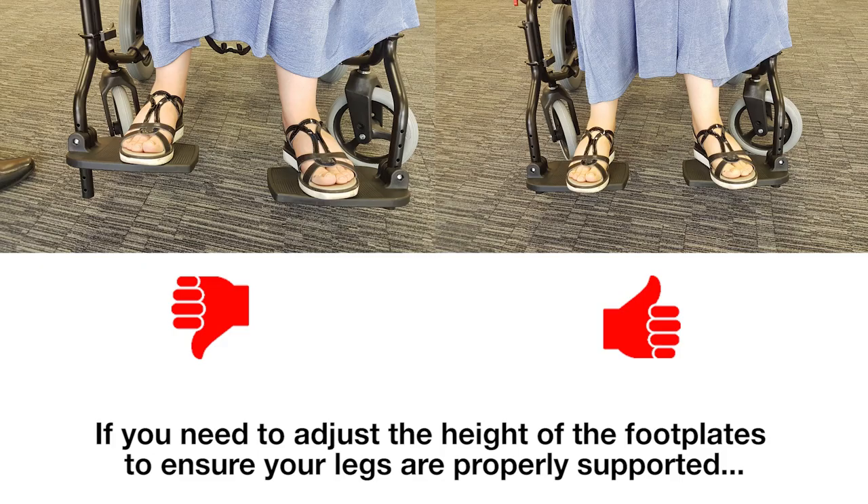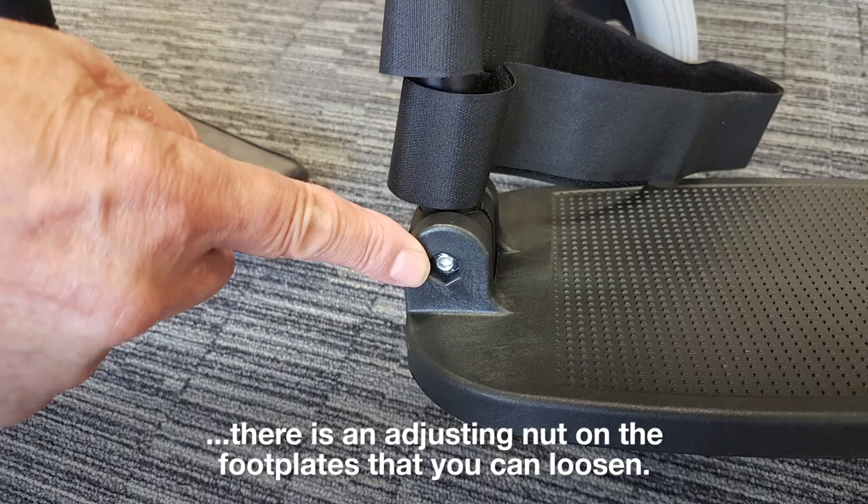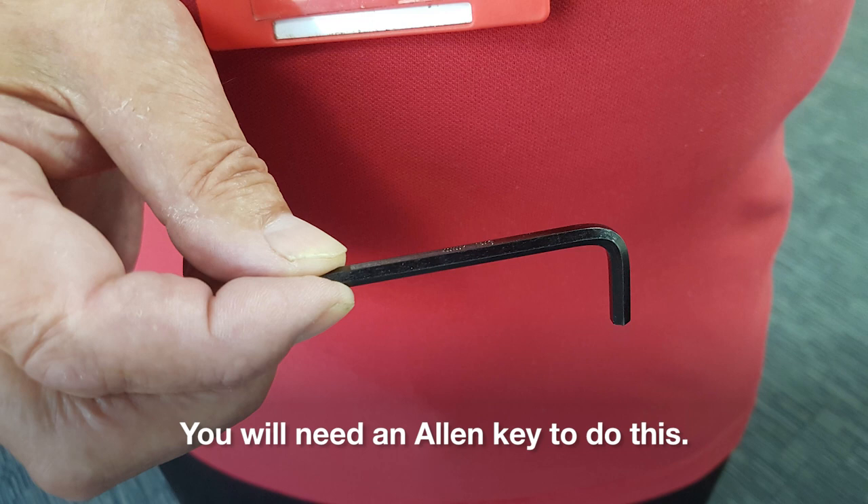Step 3: Adjusting the wheelchair. If you need to adjust the height of the footplates to ensure your legs are properly supported, there is an adjusting nut on the footplates that you can loosen. You will need an allen key to do this.